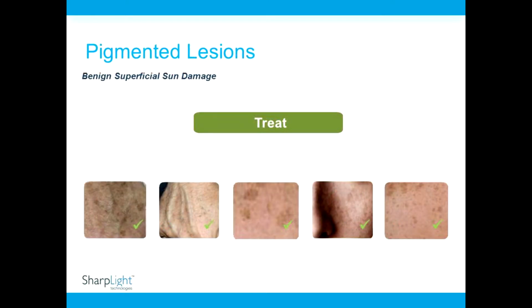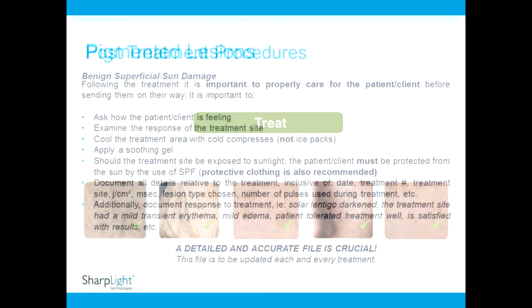These are examples of benign superficial sunspots.